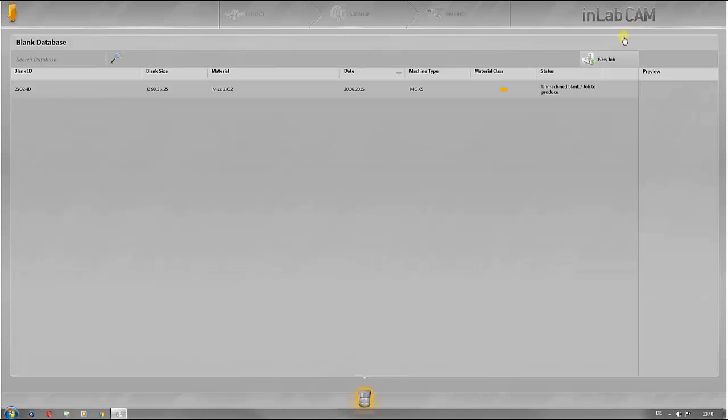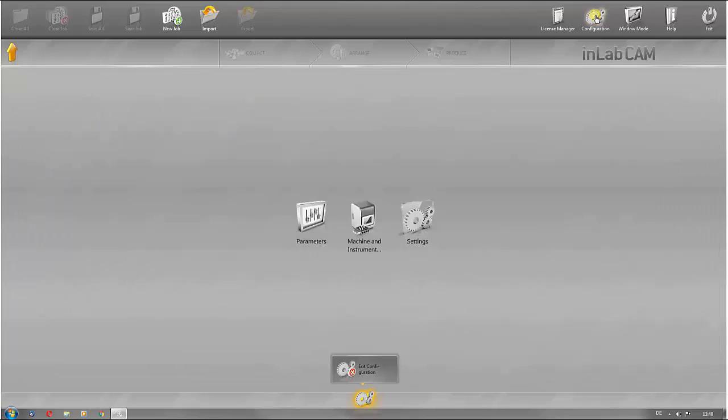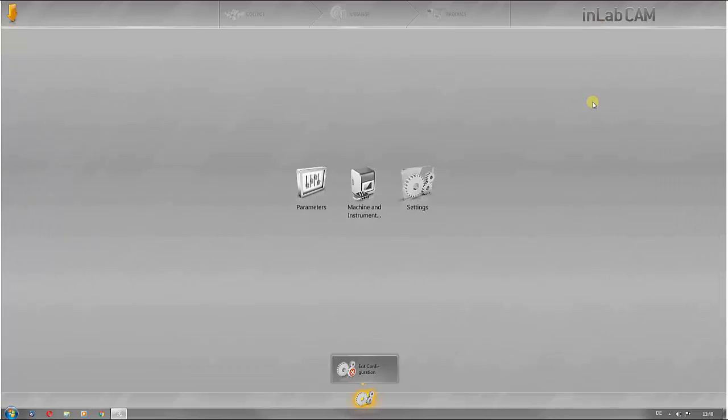You can access the software default settings via configurations. It is possible to configure general software parameters, the associated production units and the software settings here.